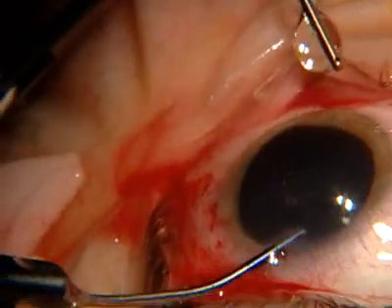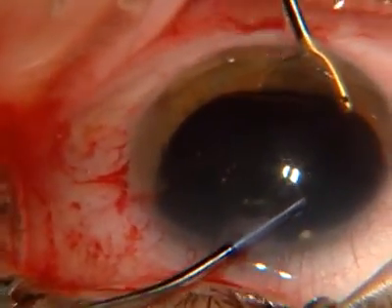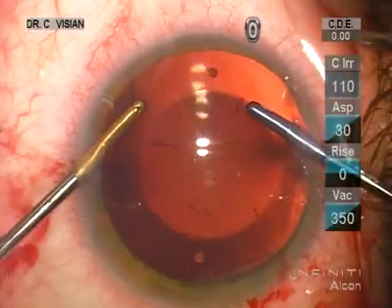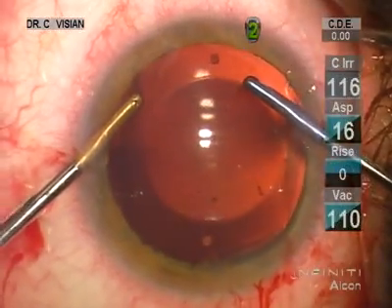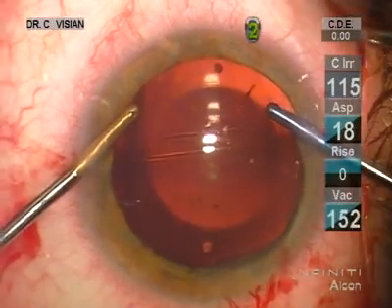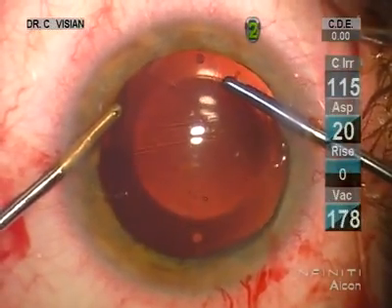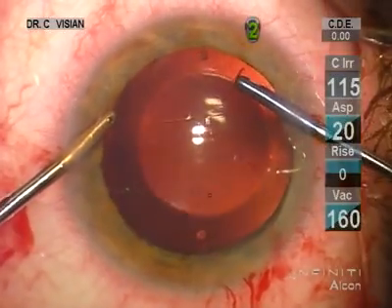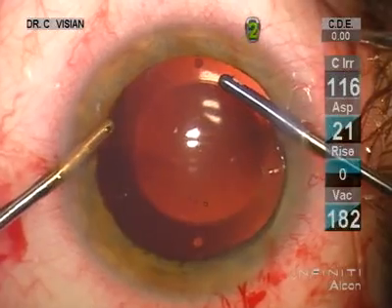I prefer using the bimanual I/A to remove the viscoelastic. We're using the Infinity on 30 aspiration, 350 vacuum. It's just a little bit of a slow process — we just take our time, spending 30 to 40 seconds to remove that viscoelastic. I think the early post-op visions are better if you remove a lot of this viscoelastic.